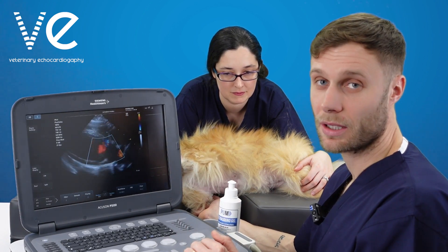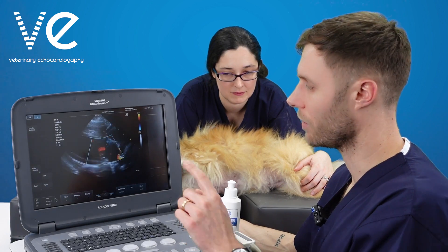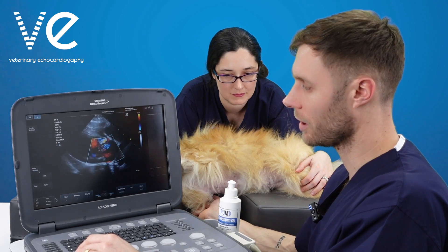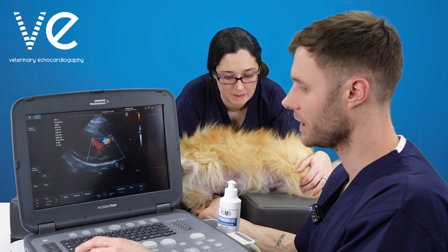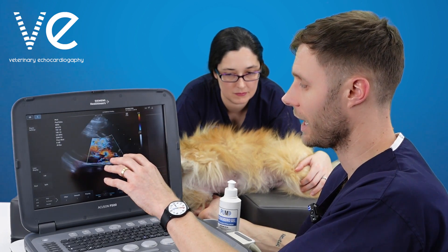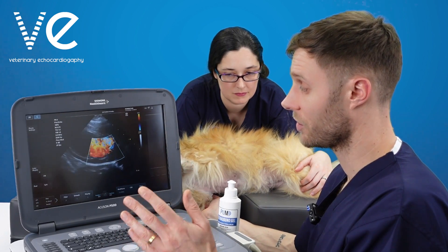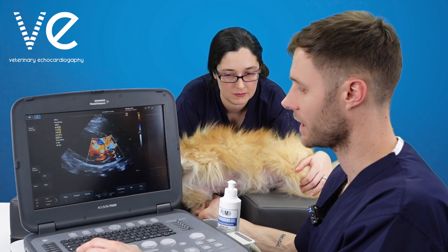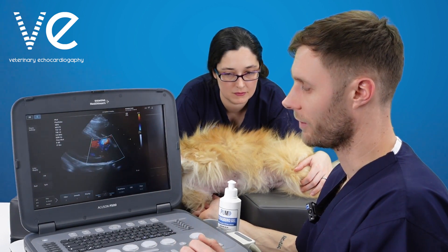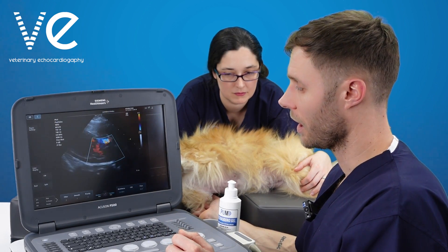The next thing to be aware of is your colour scale. We might adjust our colour scale if we're looking for low flows such as PFO — we'd drop that scale to make the colour Doppler more sensitive. But if you are getting a lot of artifact, it may be because your colour scale is too low. In the heart, blood flow is quite high velocity-wise. If I reduce my colour scale on this image, I get a lot of artifact and aliasing, making it hard to determine true flow from artifact. Increasing the scale will smooth out turbulence, reduce aliasing, and filter out lower flow velocities to make diagnosis easier.